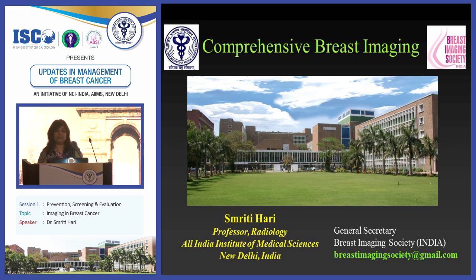And I will now jumpstart the topic because I think it's a tough task, taking you through the entire gamut of breast imaging in 15 minutes. I will try my best.